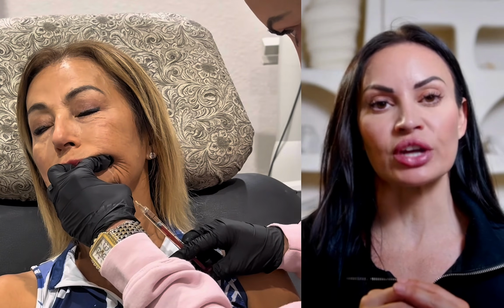I'm always painting this area. Now, one tip is to always mark your patients while they're sitting in an upright position. So I always mark them out when they're sitting upright because we want gravity to play a role. Sometimes I'll even have them leaning forward just so you could see that pulling pressure of the jowl, so you could really mark out where you want to inject the product.